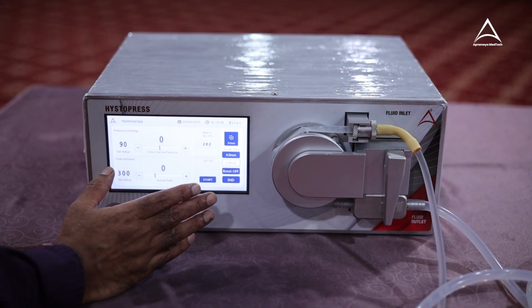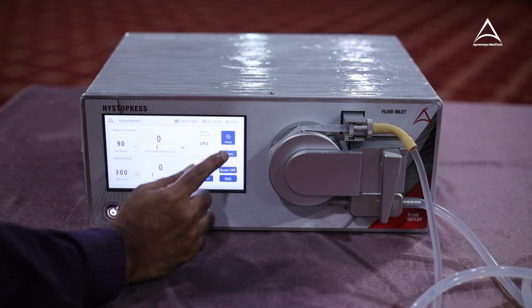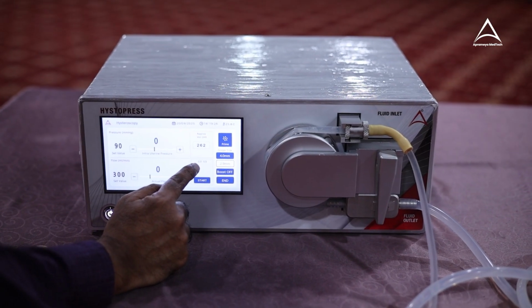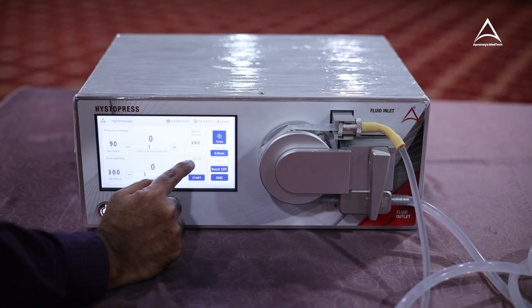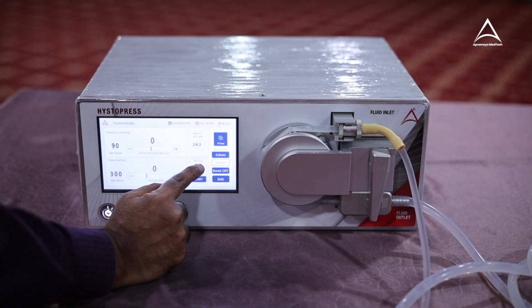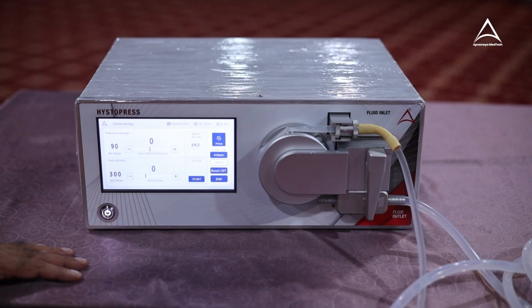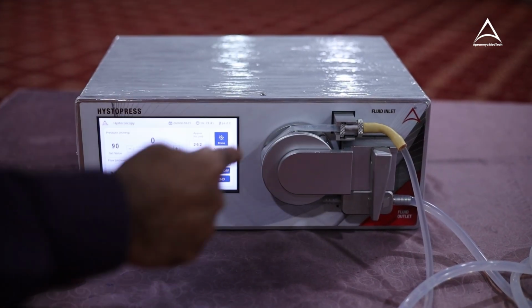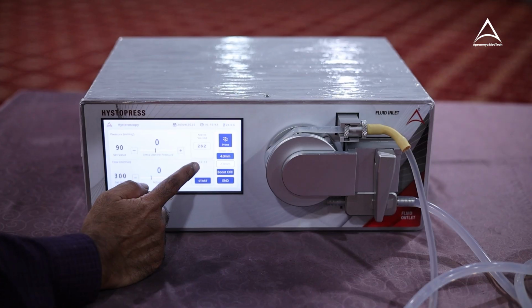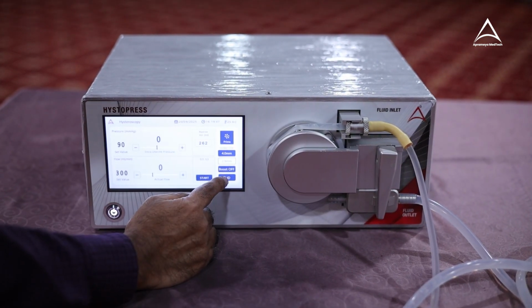Now consider this case is over. We have paused this case. Now can you appreciate the time here? There is a little stop time showing 3 minutes 53 seconds. This timing is showing the actual time when the pump motor was running, the wheel was moving. This time is given here. Okay. Now since my case is over, I will end the procedure now.